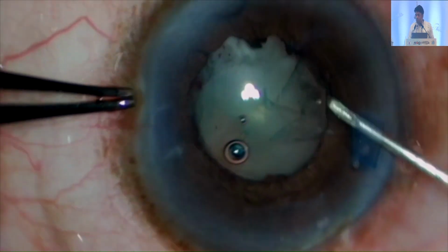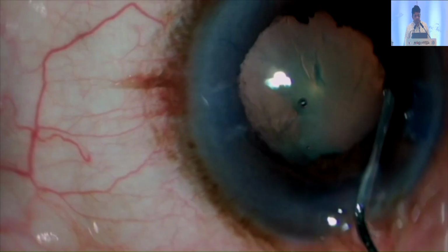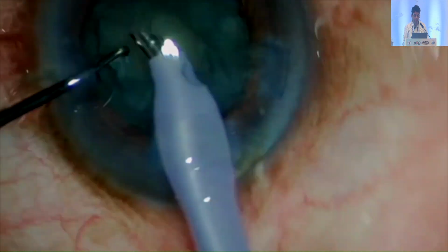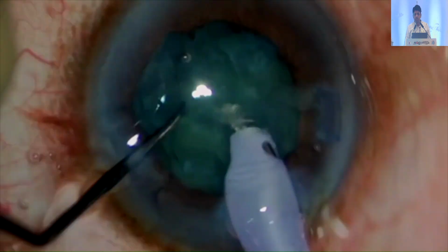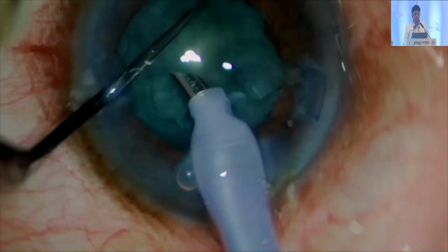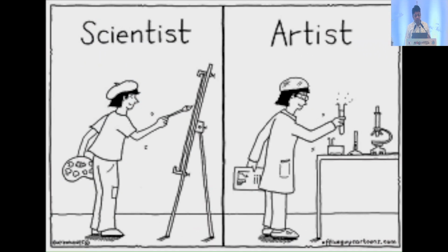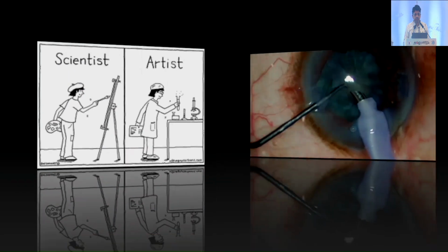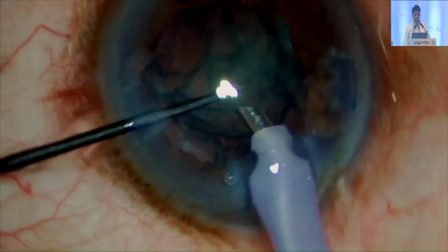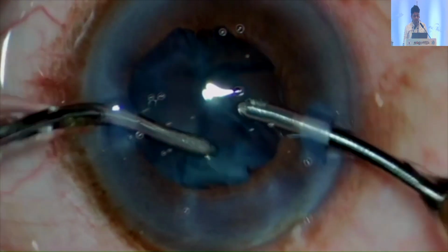As Jolly ma'am has already discussed with us, a large rhexis is always required in such cases to minimize the post-operative inflammation. And while doing the nucleotomy, most of these cases generally have softer, fluffy cataracts, and the nucleus is not so hard, and mostly small chops and vacuum may do the work preferably. We need to be an artist while performing these cases because there are multiple coexisting problems like zonulopathies. There may be pre-existing PCRs. These eyes may have experienced multiple intravitreal injections.